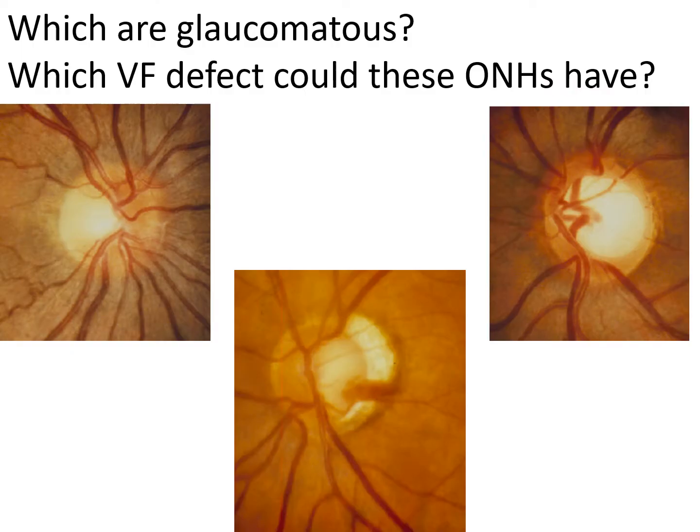So I showed you the visual field defect. I showed you the glaucomatous change of the disc. So correlation between structure and function should not be so difficult, but it's not that way. When we check an optic disc, we always have to think about whether this optic disc is normal or abnormal.